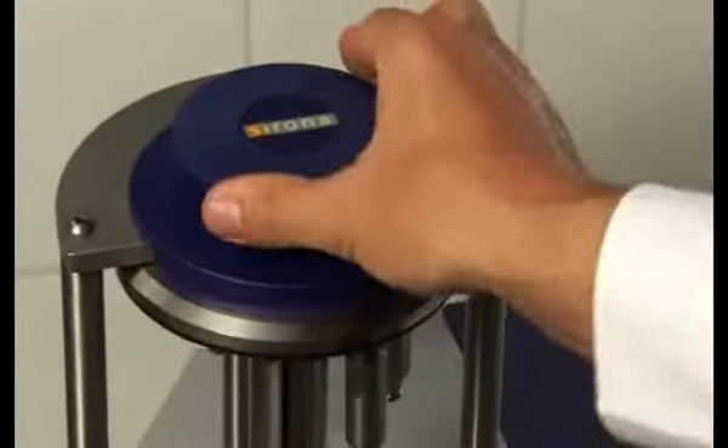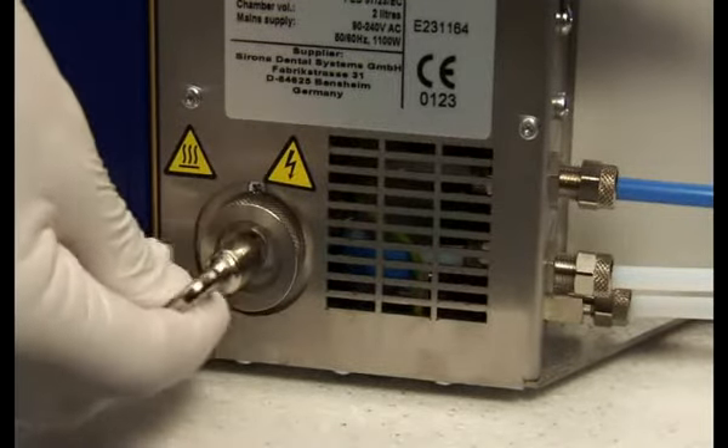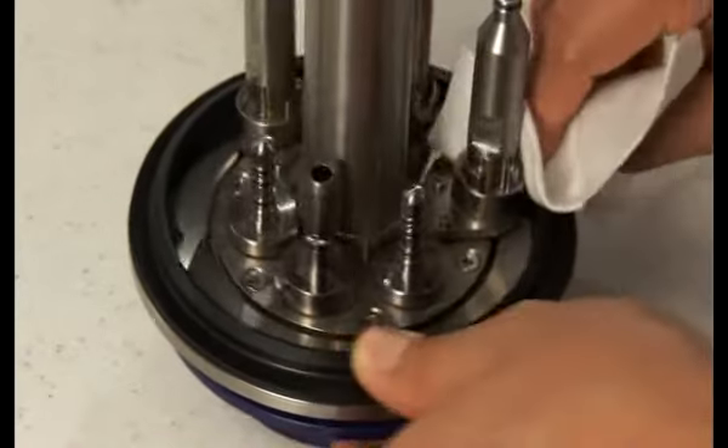Place the lid in the lid holder. Afterwards, check the O-ring on the filter cap placed on the back plate of the autoclave and tighten the filter cap gently with the filter key. Clean the lid gasket with a clean towel.